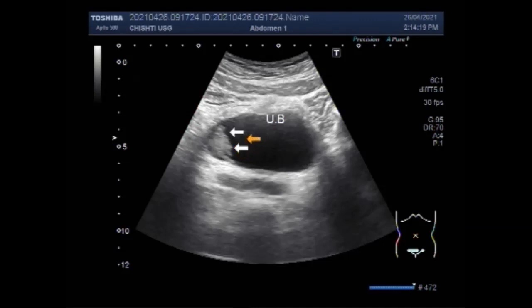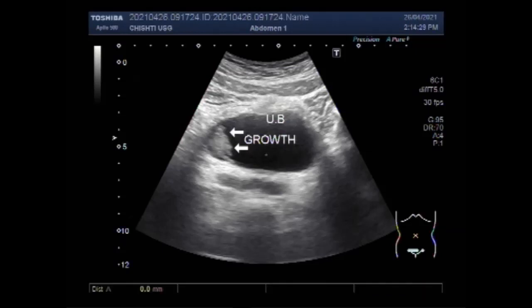Most bladder tumors are cancerous. Now you can see the physical growth, and this growth measures approximately 21.6 millimeters by 16.5 millimeters.